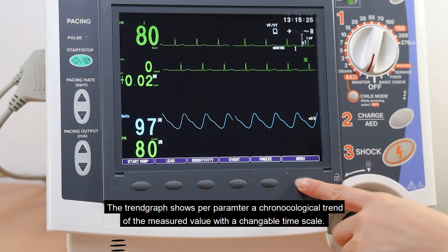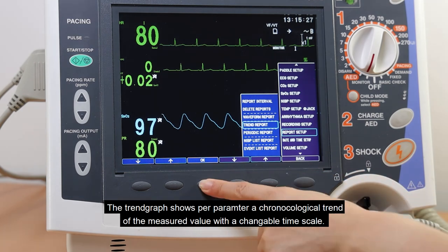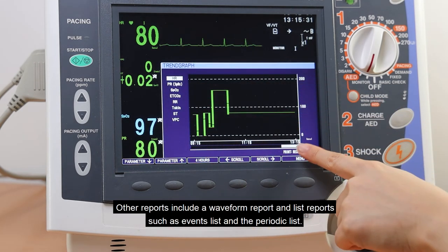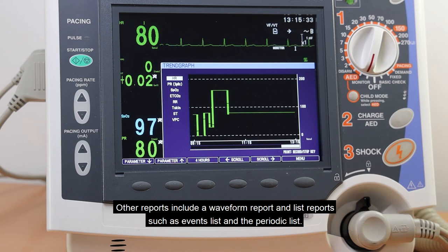The trend graph shows per parameter a chronological trend of the measured value with a changeable timescale. Other reports include a waveform report and list reports, such as the event list and the periodic list.